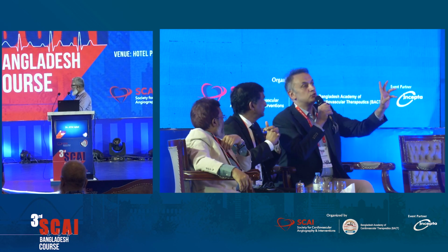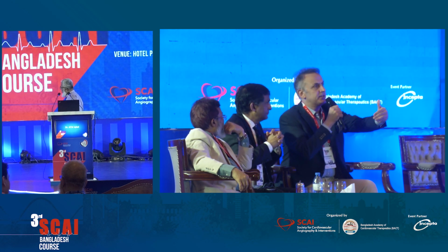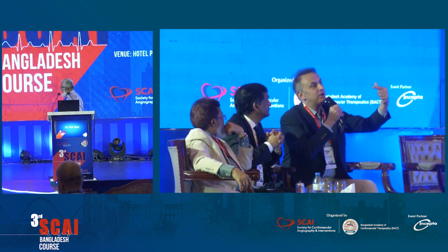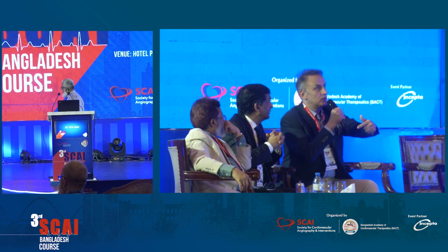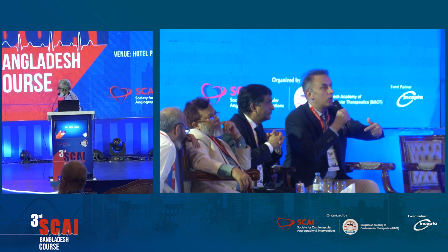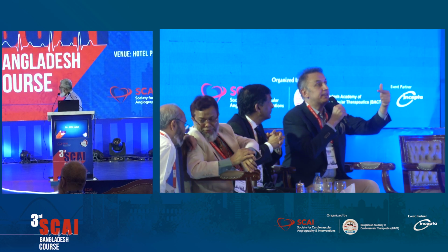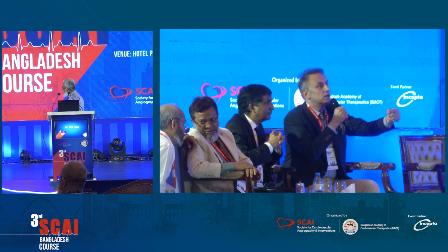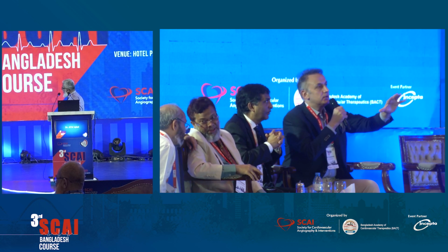But the other important point here to me, you crossed the diagonal stent, right? You did ballooning, yes, and then what did you do? You put a stent, right? No, sir, I first introduced a balloon. The balloon easily passes through. But did you do kissing before stenting? Sorry, did you do stenting?